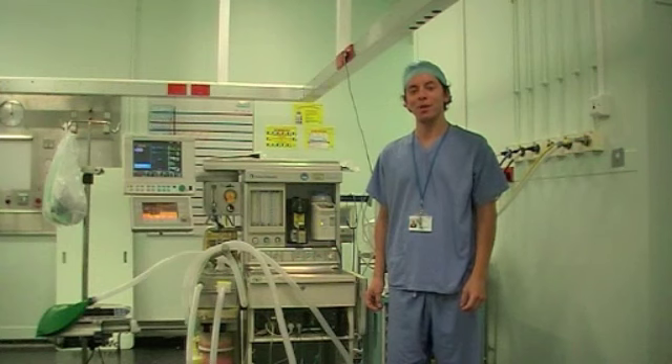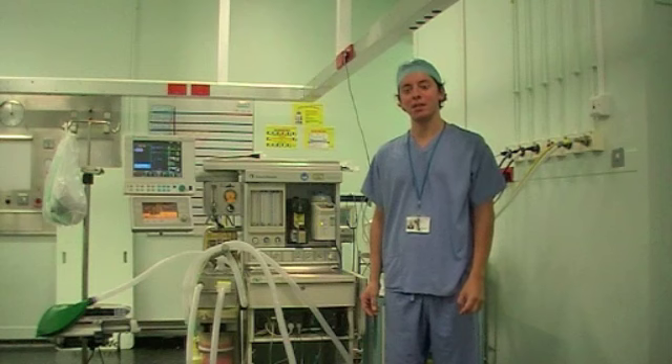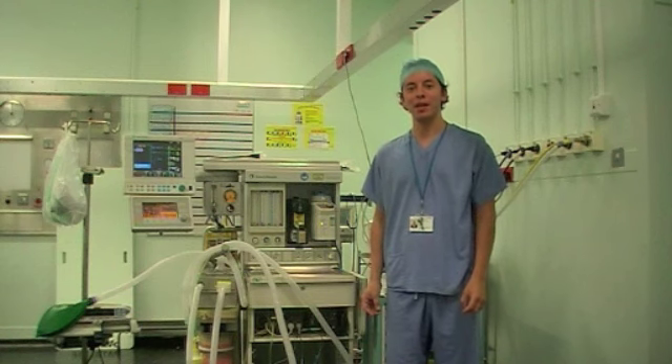Hi, my name is Mark. I'm one of the anaesthetic registrars at the Imperial School of Anaesthesia. Today we're going to be running through the anaesthetic machine check. This is based on the new AAGBI guidelines released in 2012.